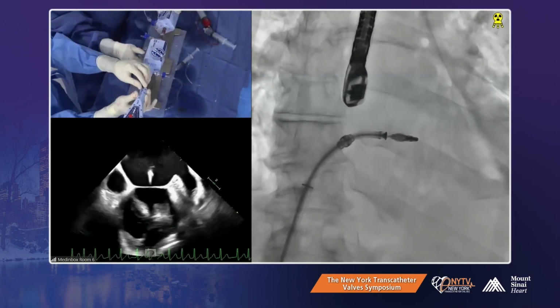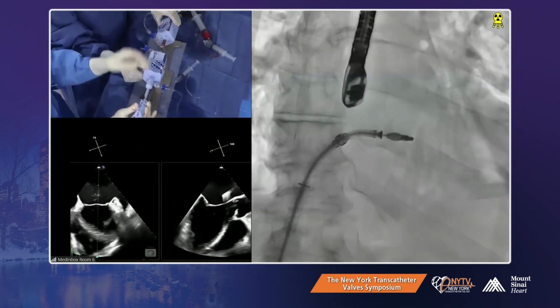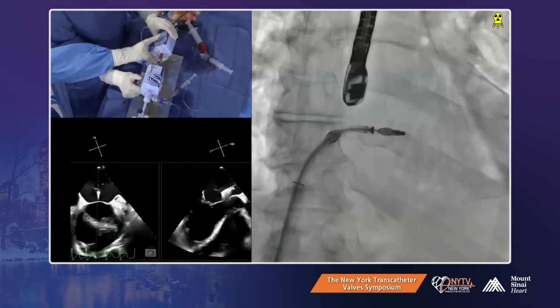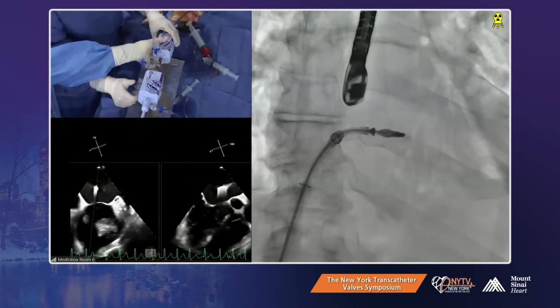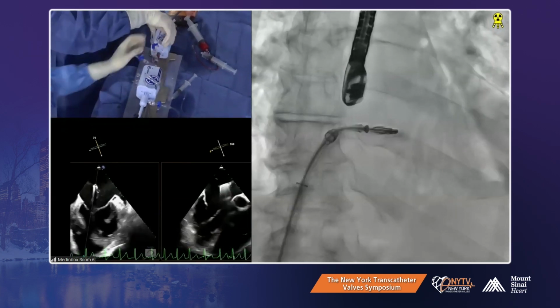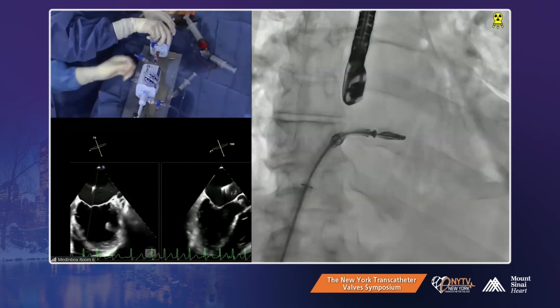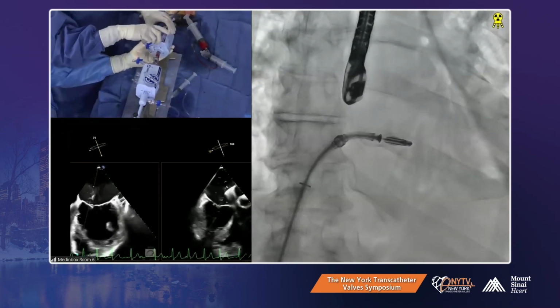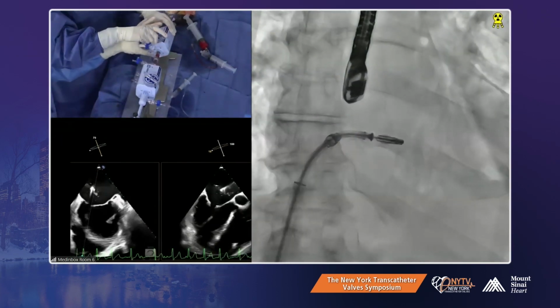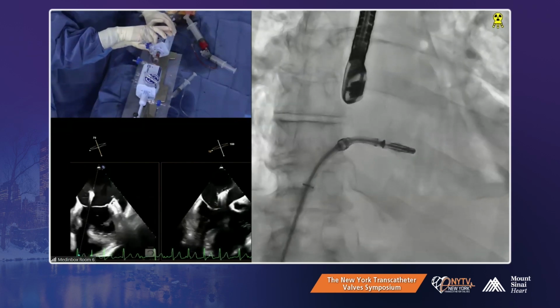Okay, bicaval looking good here, with a little bit of aorta hugger. We can go to a little plus posterior guide torque. I'm going to put a little plus here. That's exactly what we're going to do, give plus to the guide, because you have a lot of height. So that we try to optimize all the trajectory and manipulation in the LA.